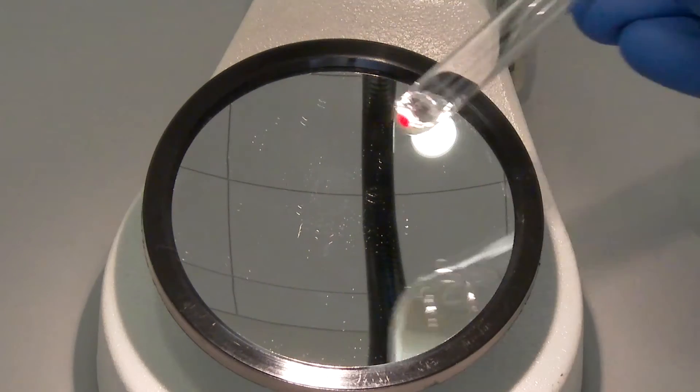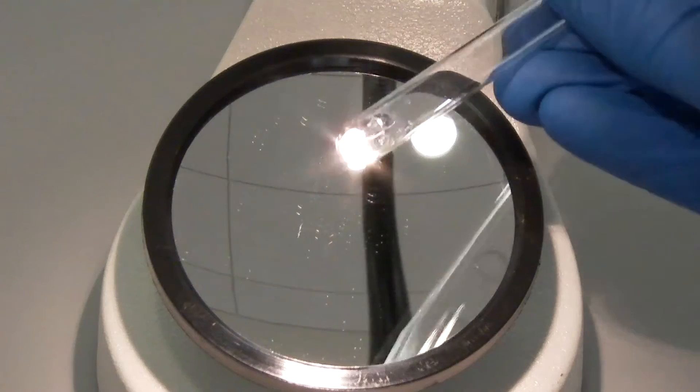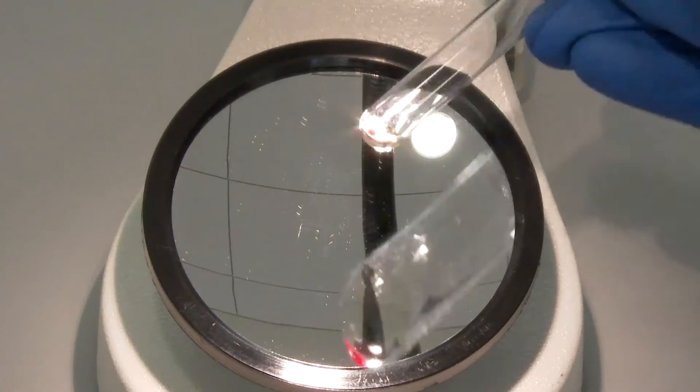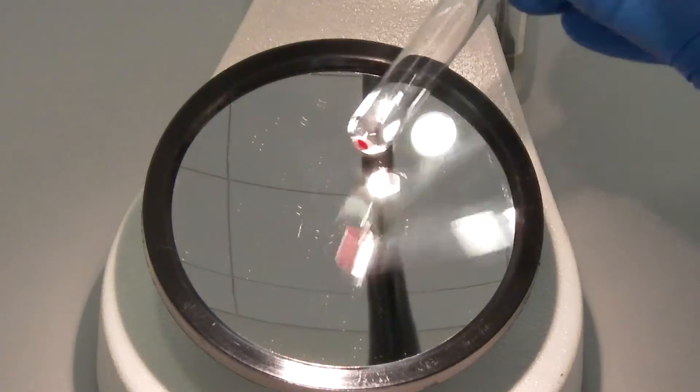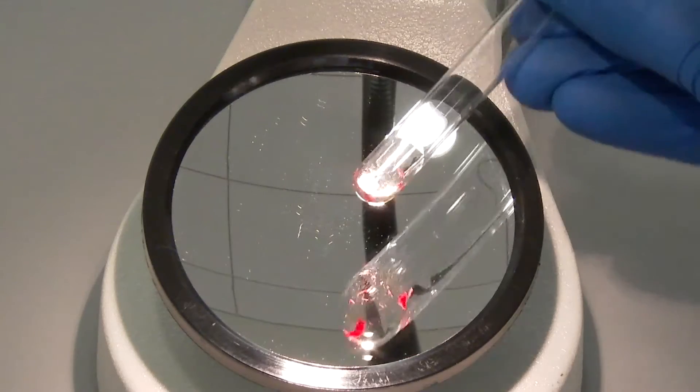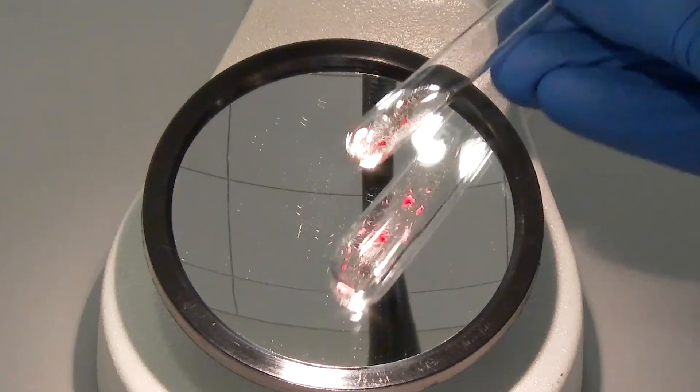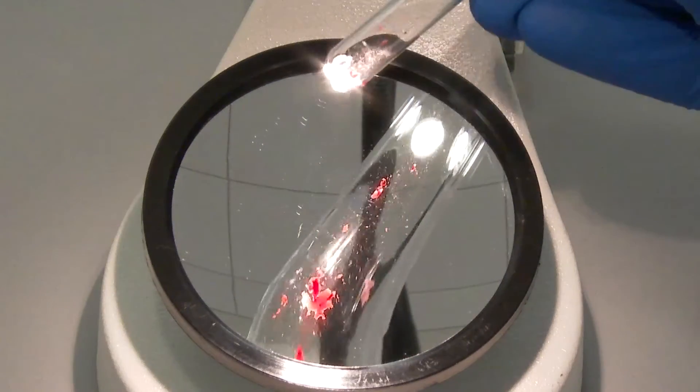Gently rock the test tube back and forth so that the supernatant washes across the cell button. Observe the edge of the cell button and look for the presence of a jagged edge or a smooth edge with free floating cells washing off the button.